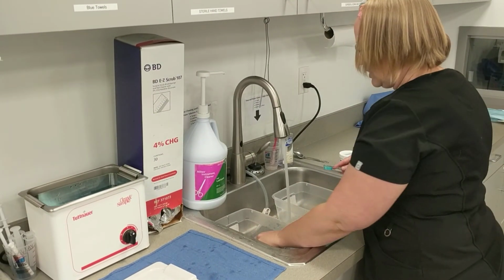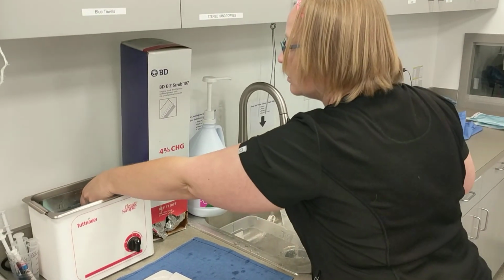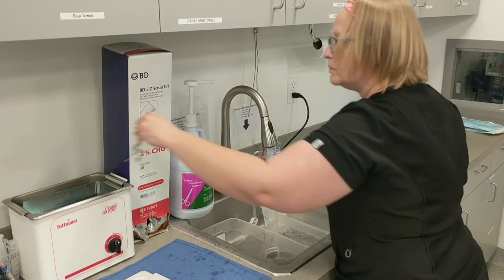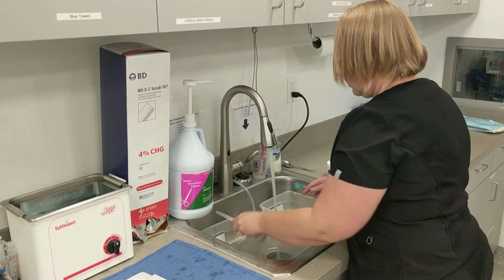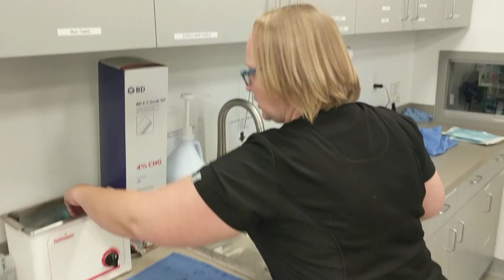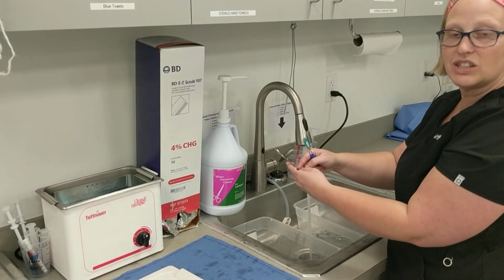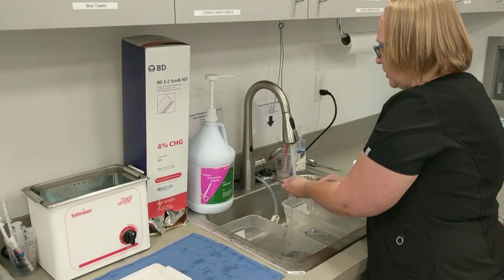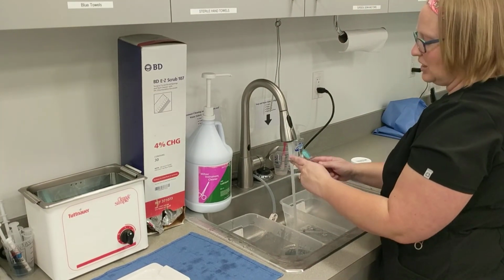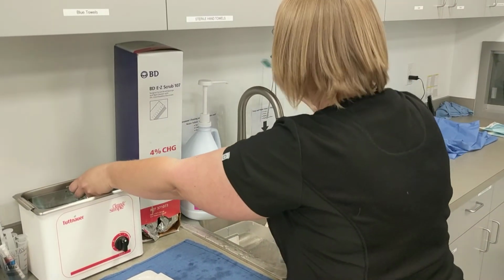I'm going to set these instruments in a staggered pattern. It's fine if you leave a little bit of debris on here. The ultrasonic cleaner's purpose is to get into these small grooves, into these joints, into the little teeth. So me just doing this with my toothbrush isn't really cleaning the instrument per se, but it is just getting that large tissue or blood clots that might be stuck on those instruments.